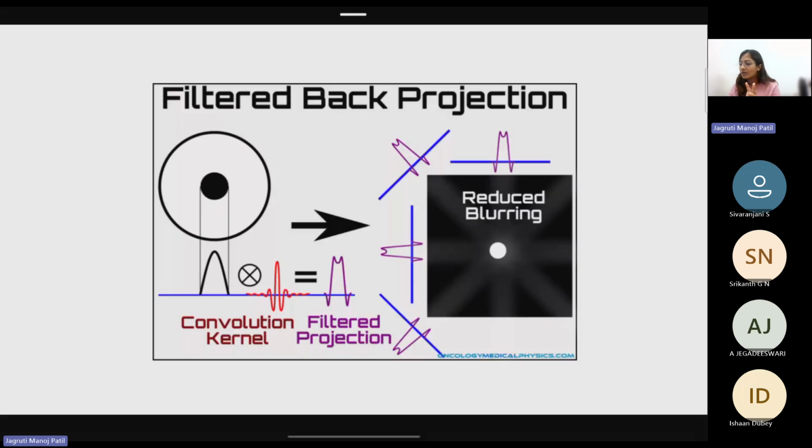For more information, you can have a look at the CT lecture; the last 10 minutes of the lecture slides are based on these two things. CT is based on filtered back projection, and there are multiple algebraic-based reconstruction methods that have been used till now, all with similar resolution of processing.